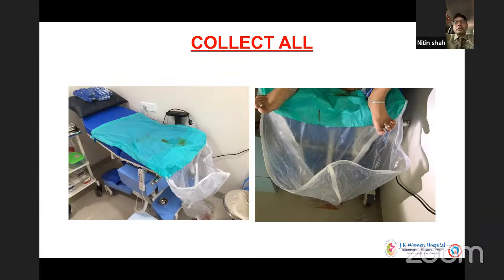One practical thing I would like to say is there is an outflow channel in the hysteroscope. You connect a suction tubing to that and put it in a separate bucket, not a dustbin which is lying in the lower part of your OT table. You keep the outflow open and you can measure very, very easily. You can just ignore a little bit of leakage here and there, but otherwise you will get a rough, accurate idea about the fluid loss. And also we have a rule.